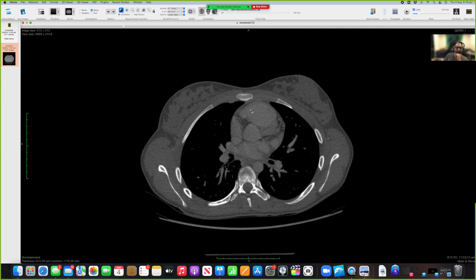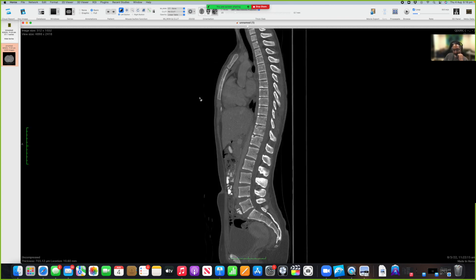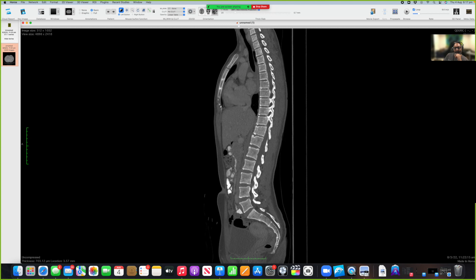Let's do the sternum. One of the best ways to look at the sternum is in the sagittal view. That's the manubrium of the sternum, that's the sternal angle or angle of Louis, that's the body of the sternum, and the xiphoid process may be here - it's not very clearly demarcated. That could be the xiphoid process, and that is probably just calcification in the costal cartilages.